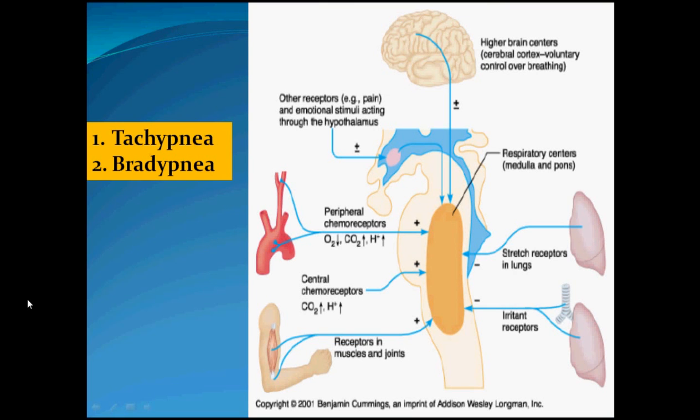Tachypnea and bradypnea mean that the patient is making an effort, and with each effort there is a response from the ventilator. If the patient is taking breaths at 20 breaths per minute, the ventilator is delivering them because the patient is making an effort sufficient to open the demand valve. If the patient increases his respiratory rate from 20 to 30 or 35, the machine is still responding because the patient is making an effort. But take care of this when you are dealing with tachypneic patients.